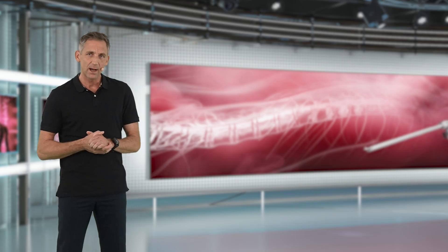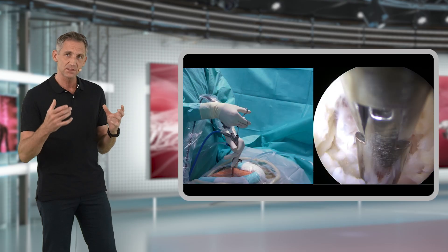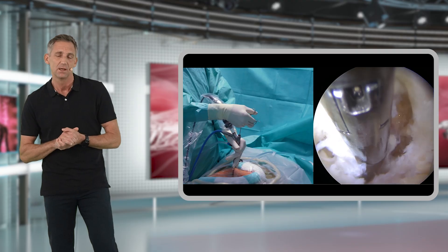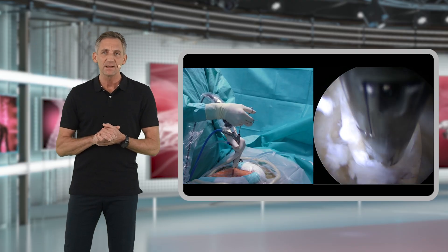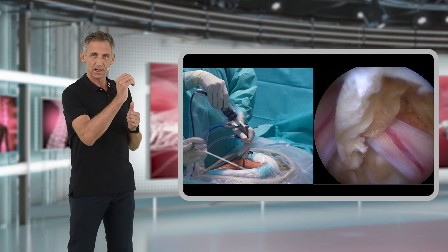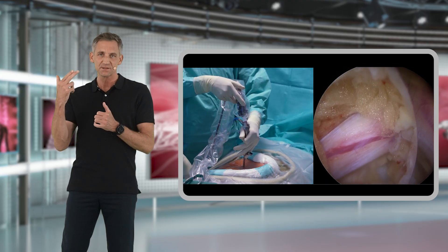Instead, I recommend other tips and tricks to remove disc fragments. You may mobilize the nerve or the dura with the back side of your forceps and then carefully pull out the disc fragment.